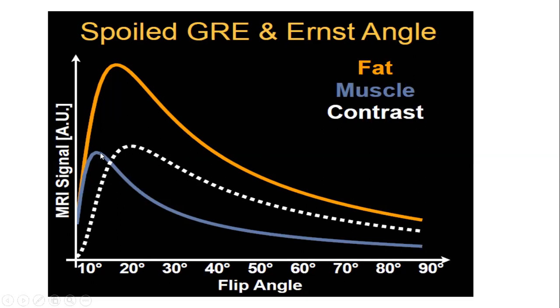So for example here, at this point, the difference between the MRI signal here and here will give us something close to this. So just draw a vertical line here. The difference between that, we get the plot we put down here.